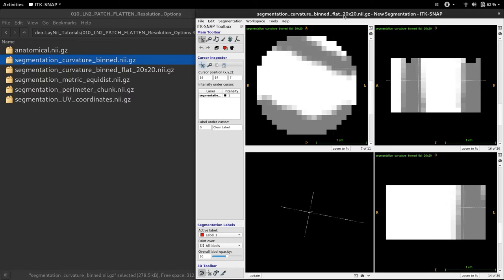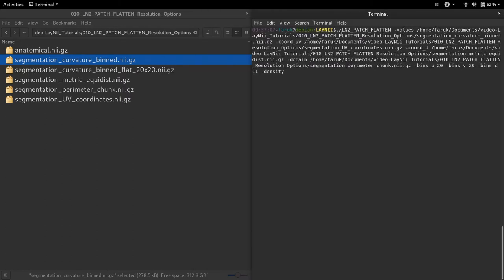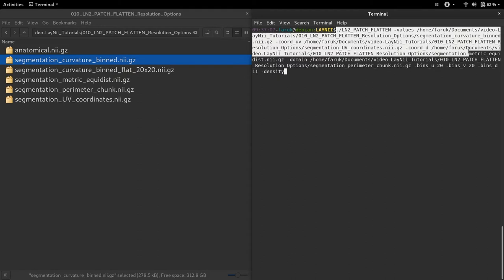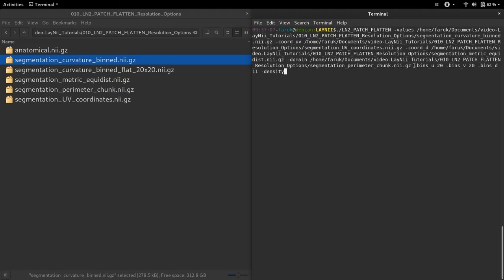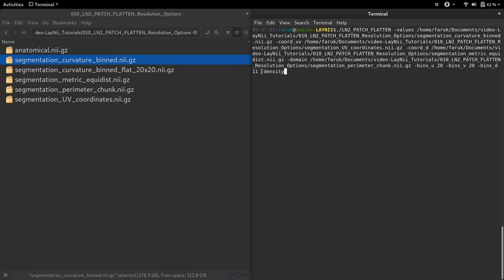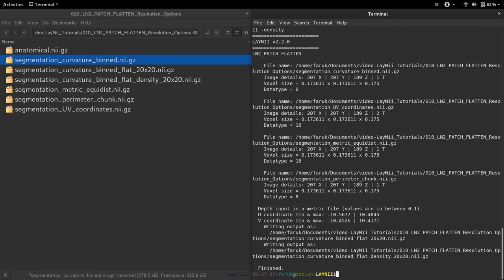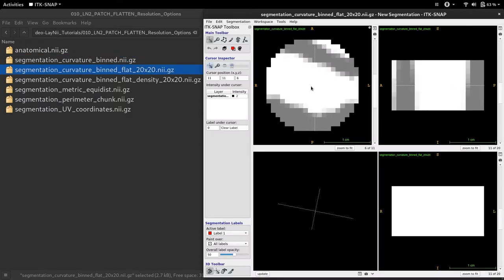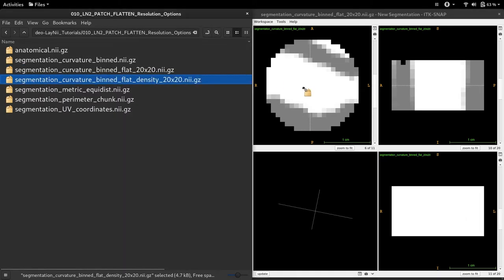To explain that, I would like to show you an extra output of ln2 patch flatten. I'm using the ln2 patch flatten program with the curvature bind values and other inputs as mentioned in the previous video. The important part we're talking about today is where we determine the number of bins. Now recognize that we have a new parameter here called density. Now let's see what it will compute. It's finished. Now let's inspect our file. Here you can see my values nifty transformed into a flat patch, and here you can see an extra output called density.